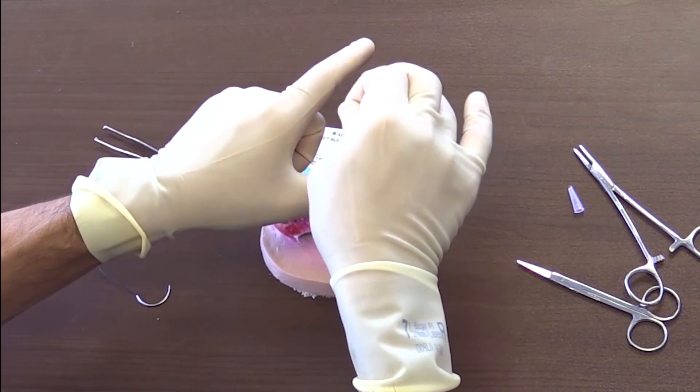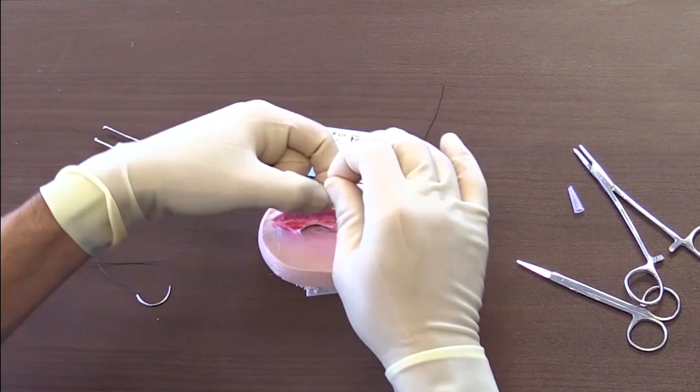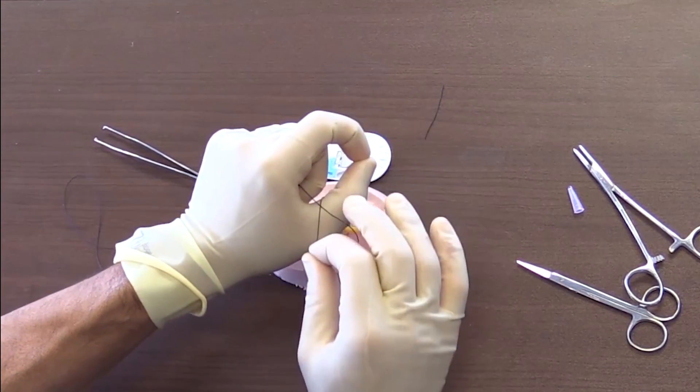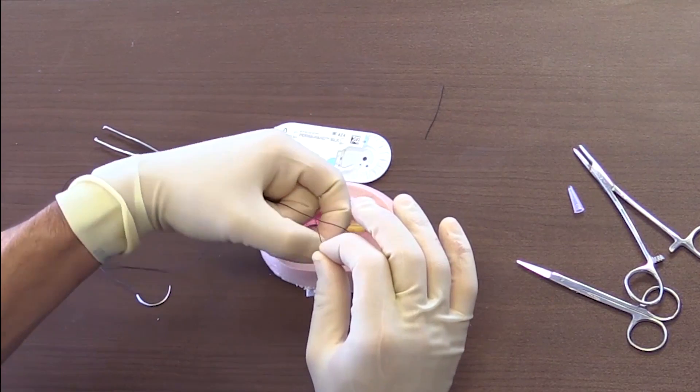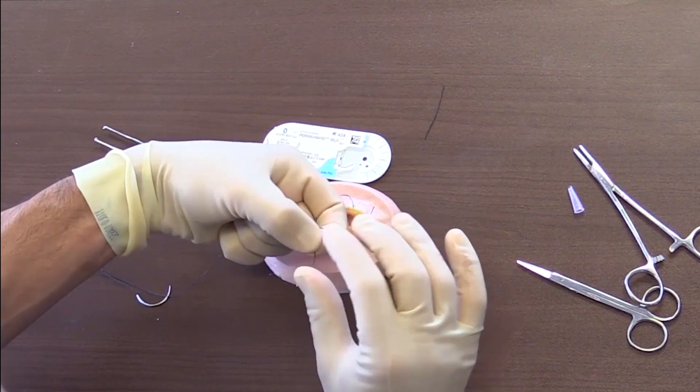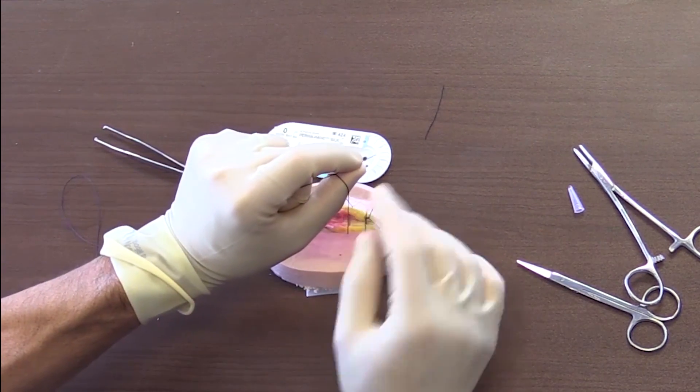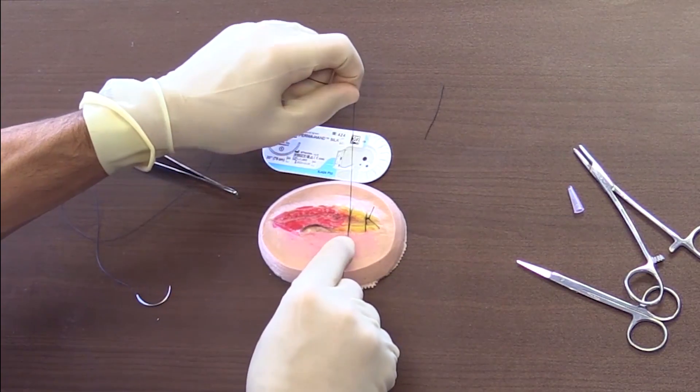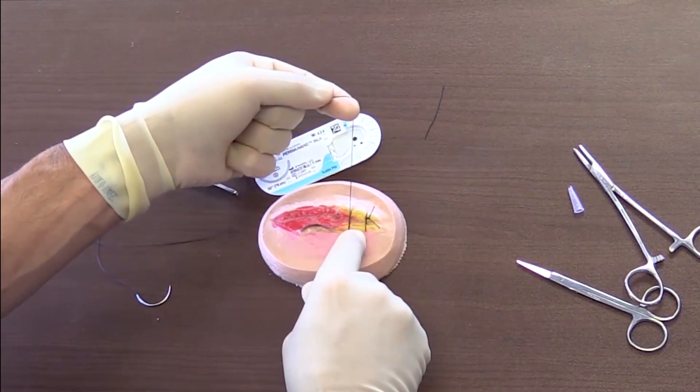And now you see we have this hole, and then I'm going to bring it over and bring it back over. Now grab the suture and go through again. And now notice we want to lay it flat, so we're going to go this way. This time I did not do a double loop, I did a single loop.